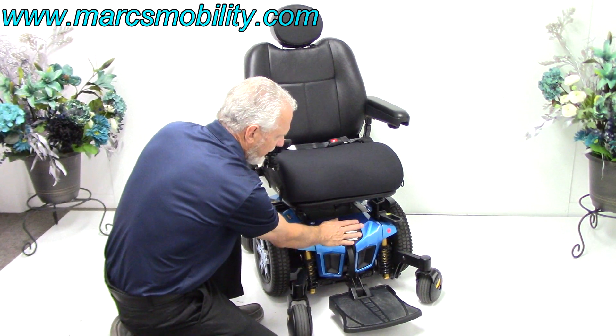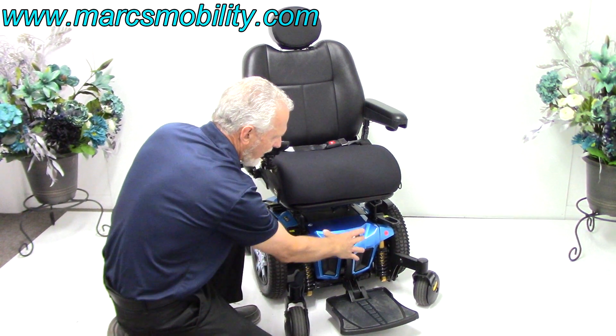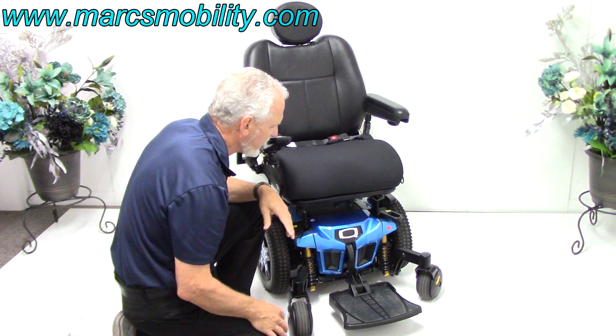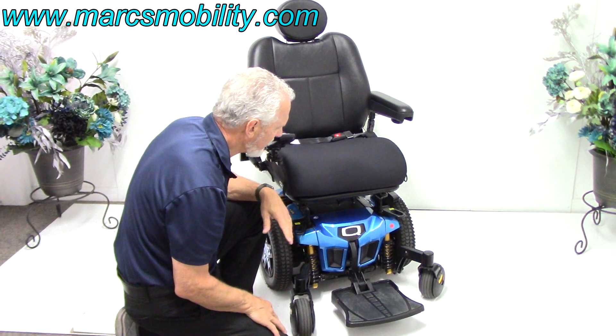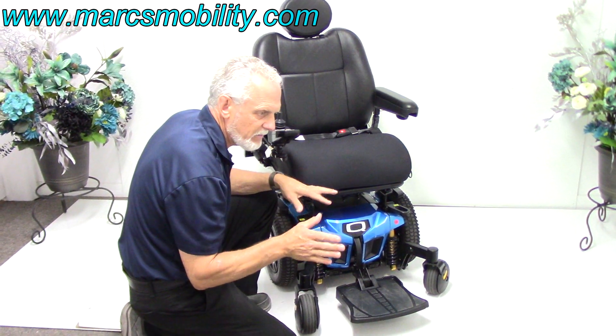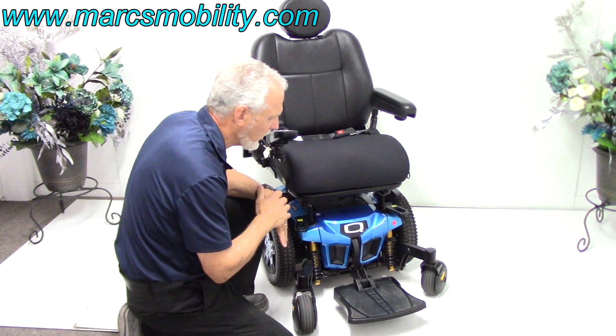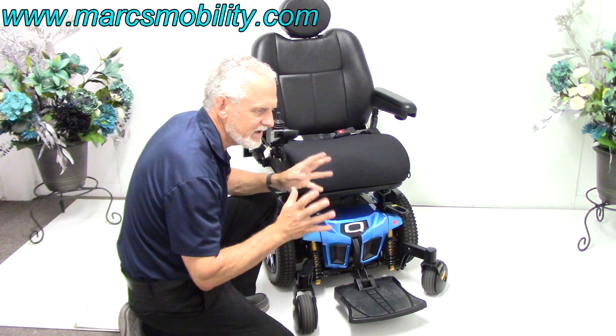The batteries in this chair always come out from the front. There are two batteries in here — a Group 22 and a 55 amp battery. You'll get about 13 to 15 miles on a battery charge, depending on where you're riding the chair, the weight of the user, and what kind of surface you're on — so everybody gets a different distance.